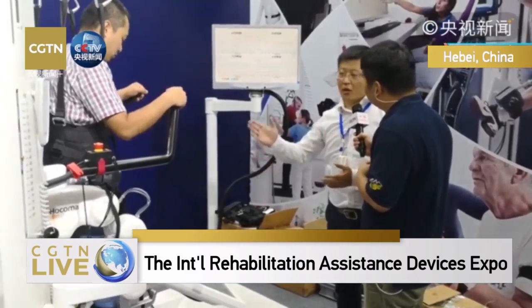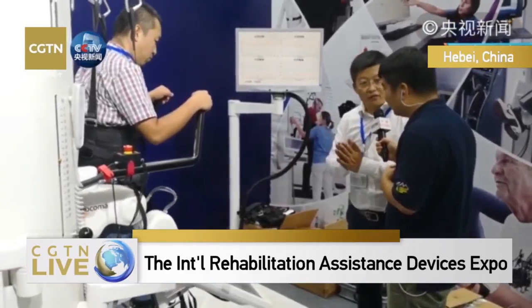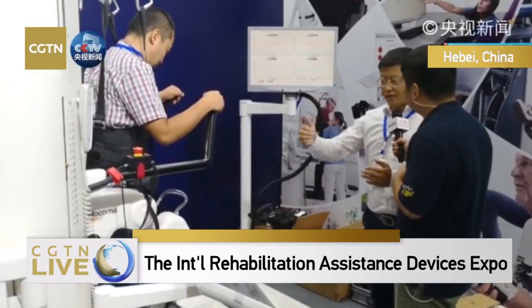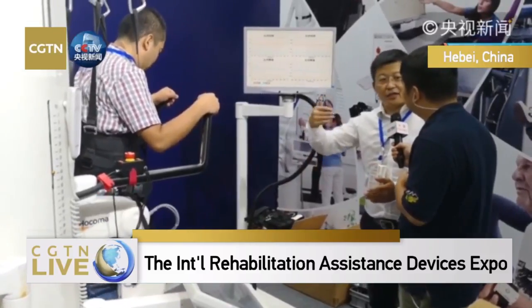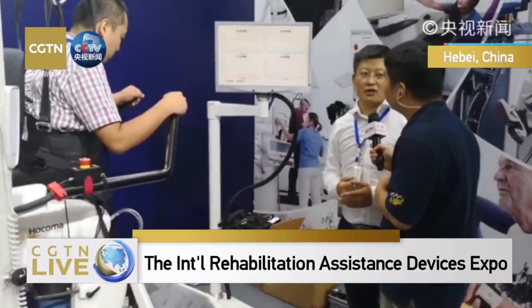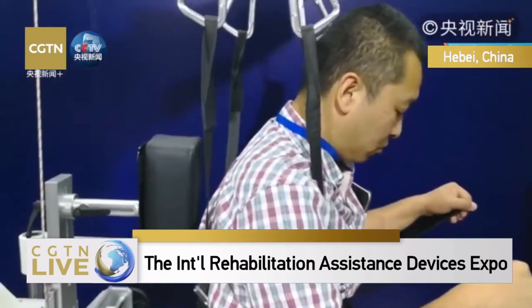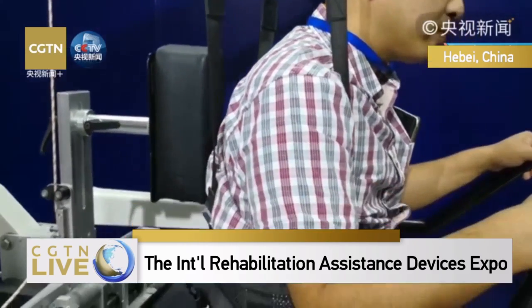Sometimes there is just not enough opportunity to do that. Therefore, with this assistance, every patient can have access to a personal therapist so that they can start the recovery as soon as they can. At this golden period, it can greatly help the rehabilitation process of the patient.